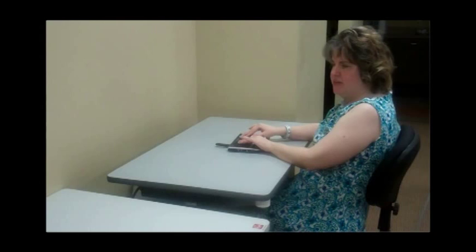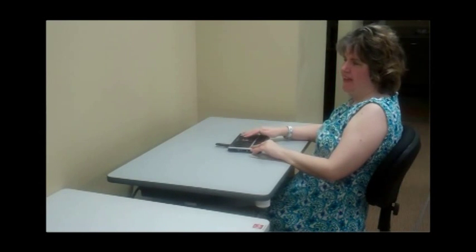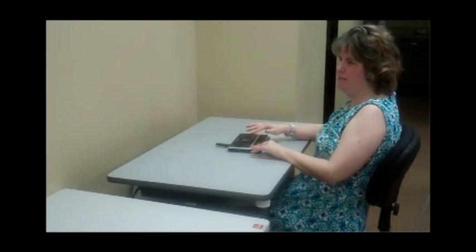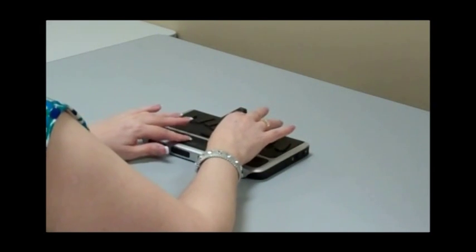Now we're going to go back to the main menu, and this time I'm going to go to the planner and show you how we do that. Rather than going through the menus, I'm going to hit the letter P. Key plan menu. Key plan menu, and it takes us into that menu. Open planner. Open planner.